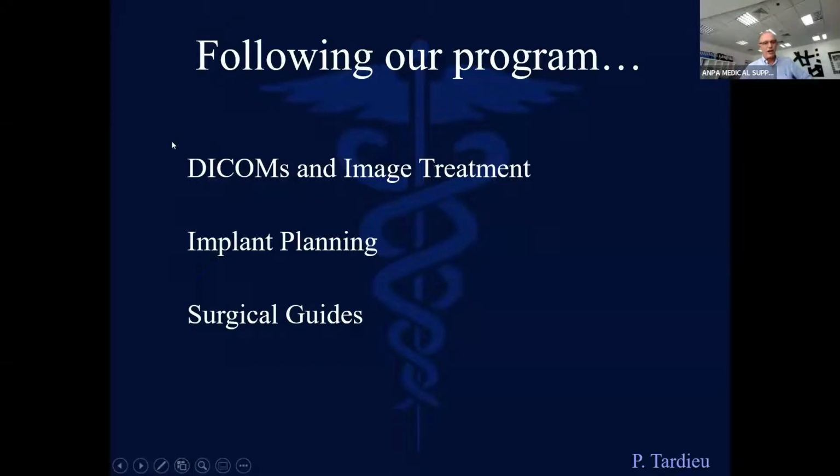first of all, last time I started with the Dicoms. What is a Dicom? How we get the image, what kind of image treatment we do, and all that was done in a previous webinar. If you did not attend this webinar, we can forward to you a link. You will have to ask Arshad. He will send to you a link to know about all these things, which are really basic things that we need to understand. The second step today is implant planning.